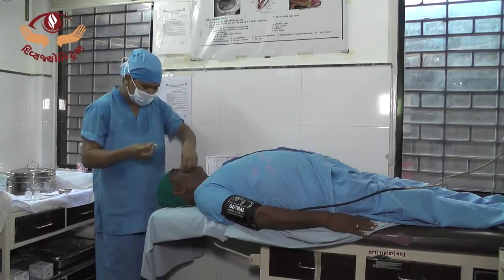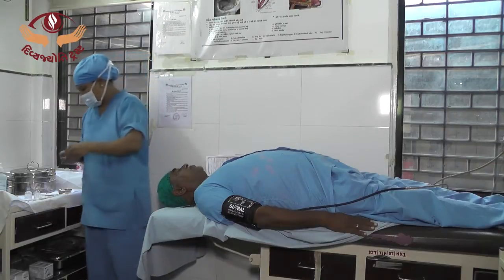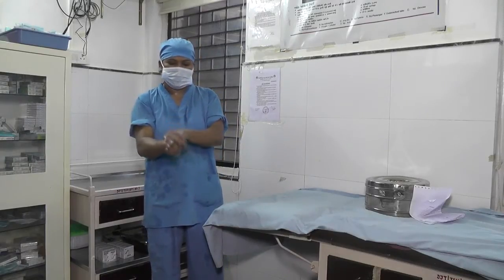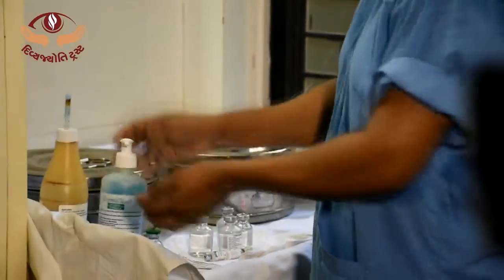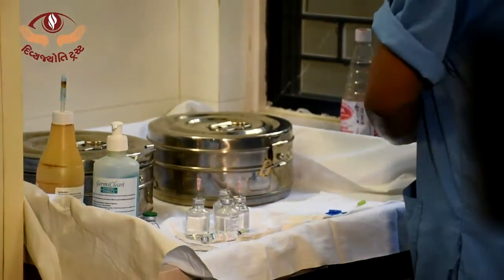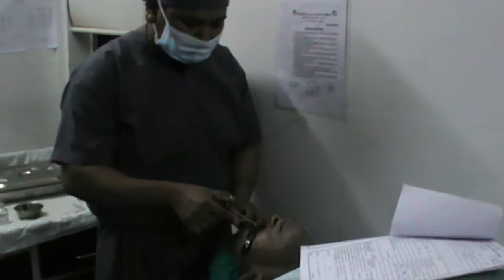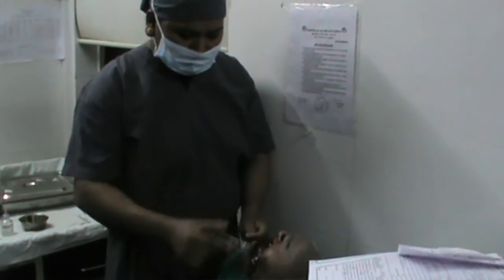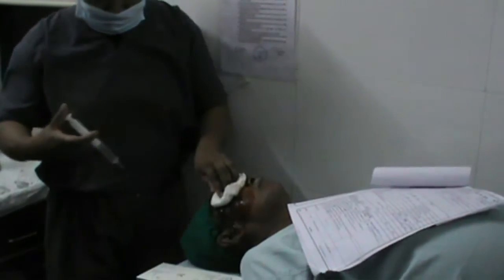5% povidone iodine eye drops should be instilled in the conjunctival sac at the time of the block. Hygiene hand wash before each block should be done and then chlorhexidine hand rub or equivalent solution should be applied on hands. Allow it to dry for 30 seconds. Painting of the periocular region from lateral to medial side with particular attention to the eyebrows and lid margin should be done with cotton swab dipped in 10% povidone iodine before giving block.